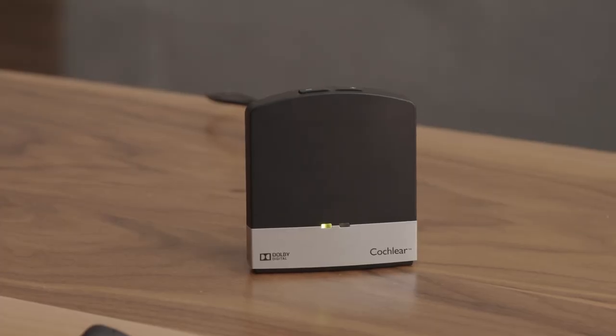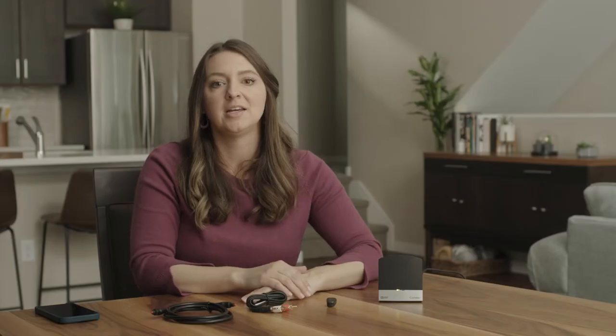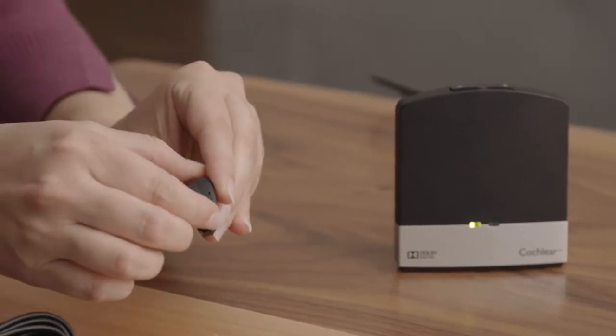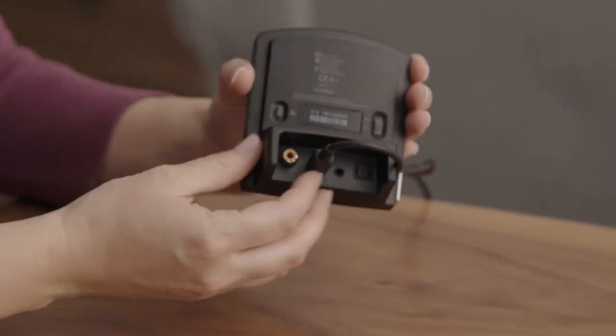You'll see a steady green LED light turn on in the front of your TV streamer. Next, remove your processor and turn it off by opening the battery compartment door. To begin the pairing process, press the pairing button on the back of the TV streamer.